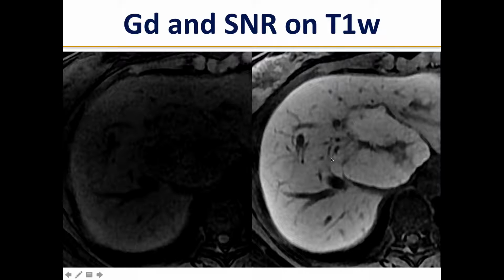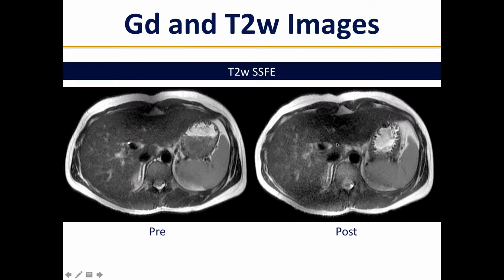And now for another extra credit question, what liver mass is this? The hint is I was very careful not to call this a tumor, because this is not a tumor. This is benign, it's focal, it's nodular, and it's hyperplastic. So this is a focal nodular hyperplasia, and we'll talk more about that later as well.